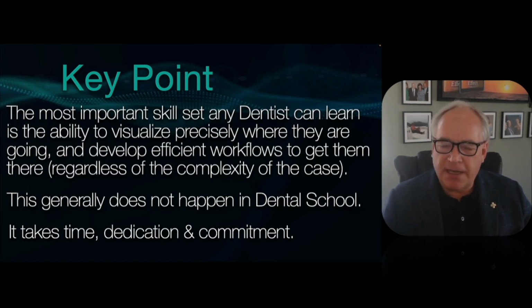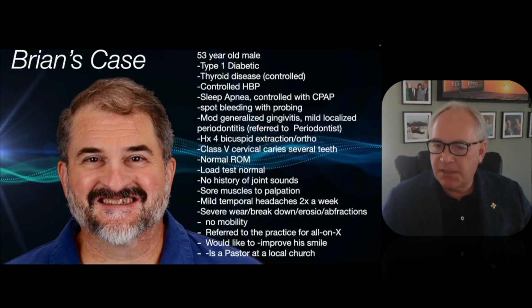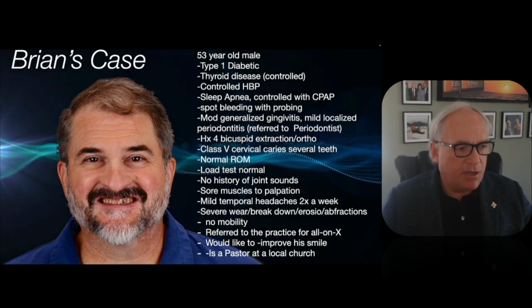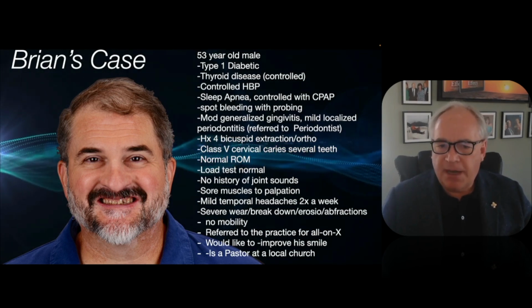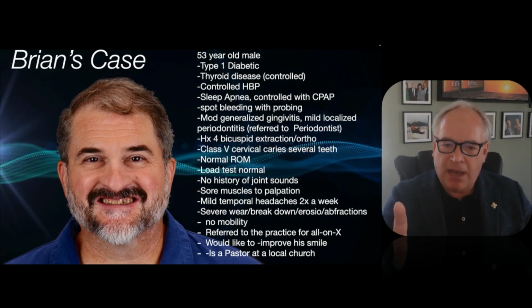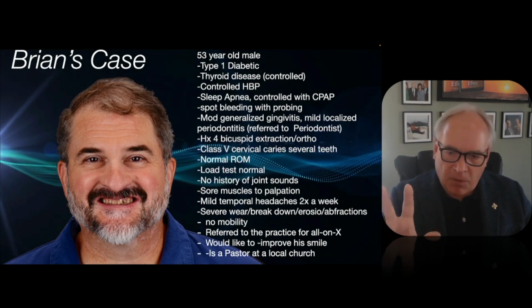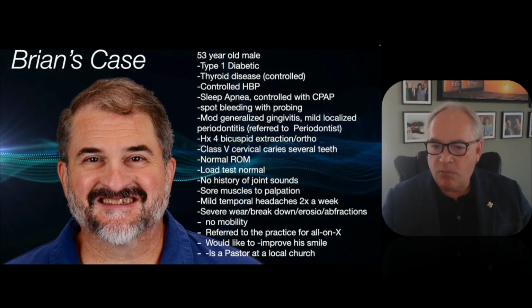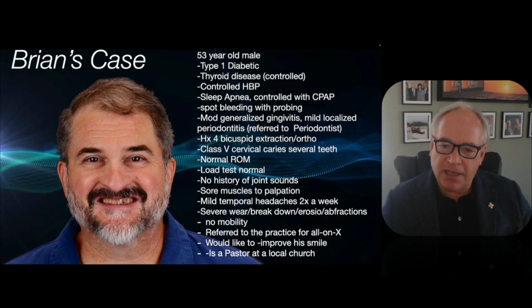I'm going to flip it upside down. Usually I start with principles, but I want to talk about a case, and I want to look at Brian's case because Brian is interesting. We'll go through his problem list here in a second. But I want us to look at a case of how we can utilize both these principles and how we can utilize digital workflows to plan where we're going as well as execute the case.